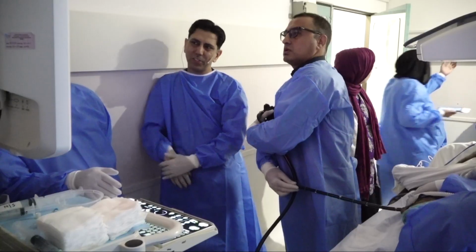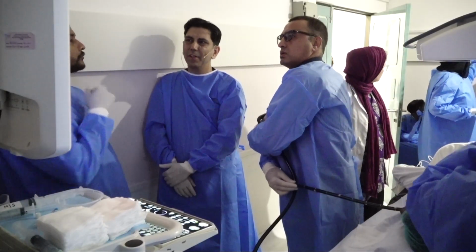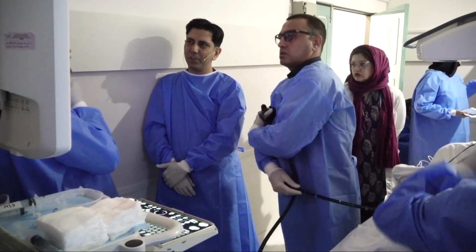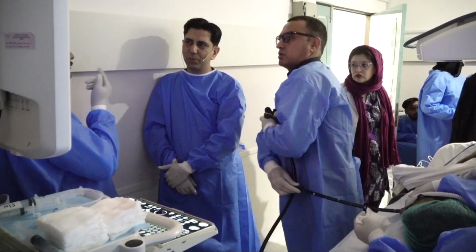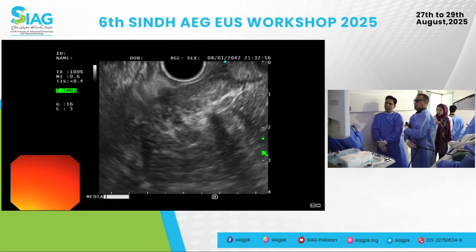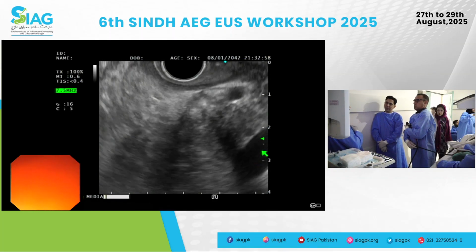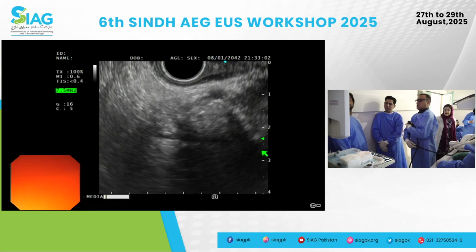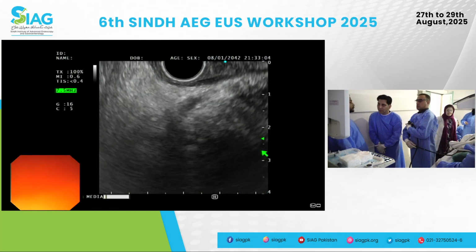Nice view. No. That's going to be dipping down. Must be a vessel. Okay, come down, come down, come down, come down. Very nice, very nice, very good. Good. Excellent. Gently keep withdrawing, keep withdrawing, keep withdrawing. Very nice, very nice. Good. You've probably fallen back.